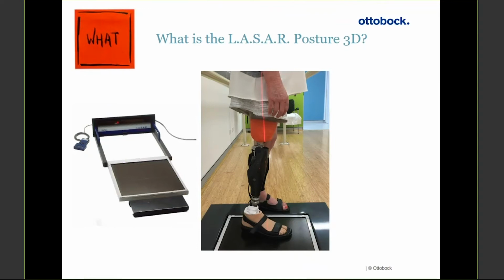That force sensing platform had a projection system, a laser projection, this small little red laser here, and this is what is projected onto the patient. The information you're getting is the center of pressure of the foot, and then it's projecting what would be the vertical component of the ground reaction force. So only the affected side, the center of pressure, and the vertical component.